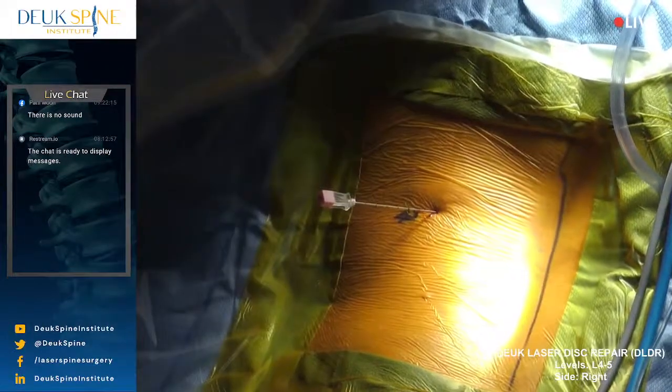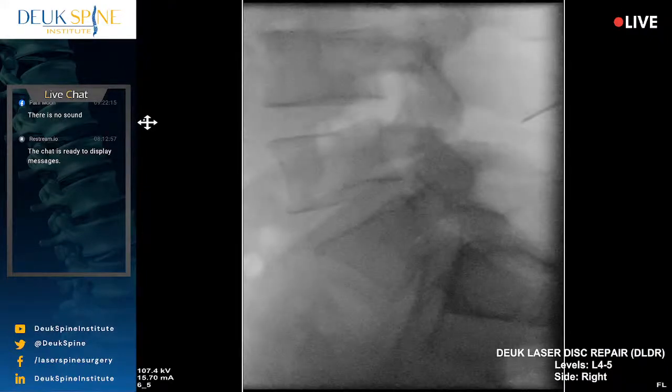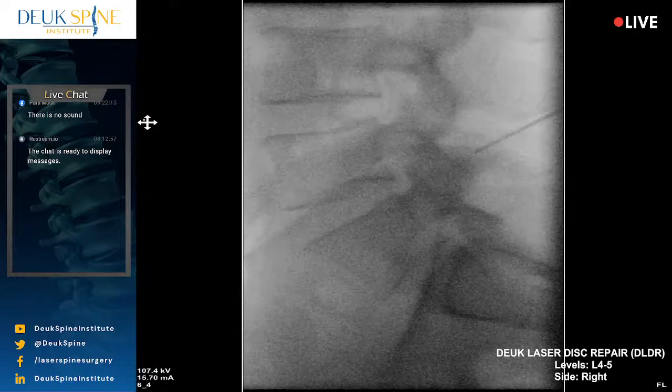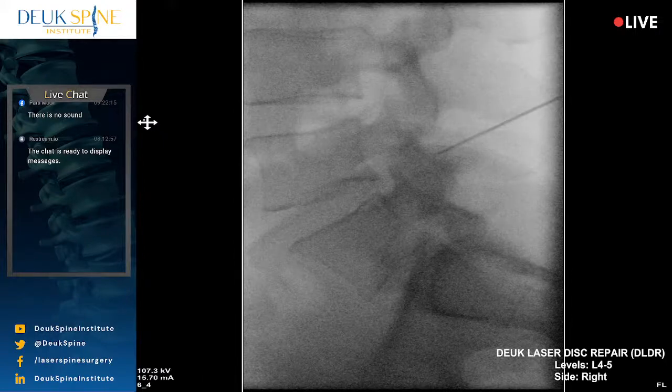Shot? Just lay still, you're fine. You're doing really good. Shot? Yeah, I understand. I wish there was an easier way to do this, but I need you awake for this part to help me. It's all about safety and verification of this level. Shot?